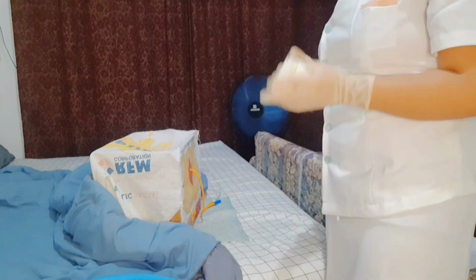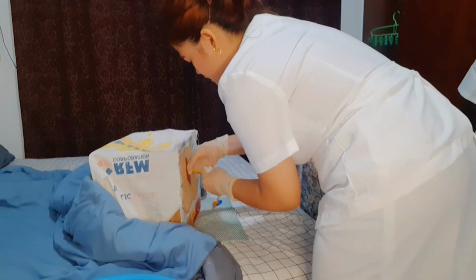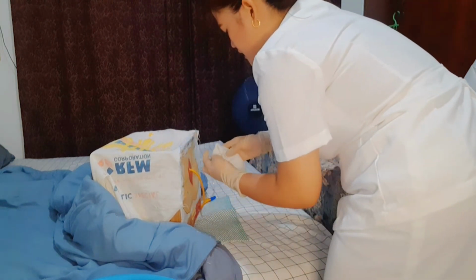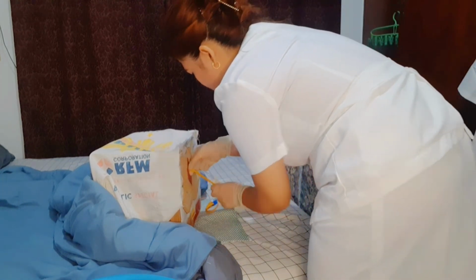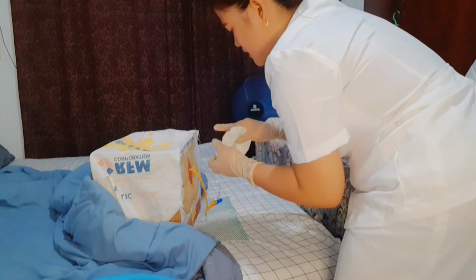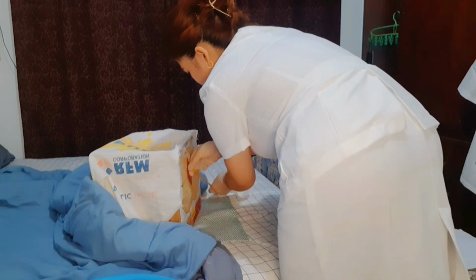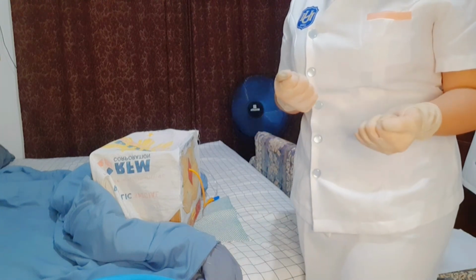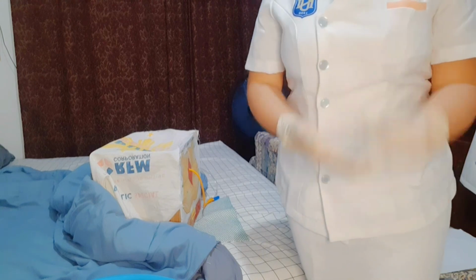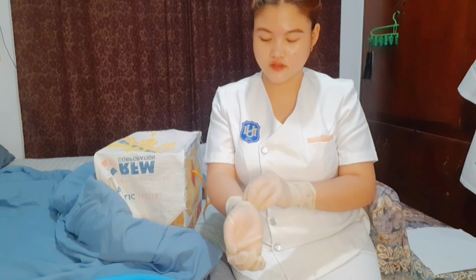And then after that, of course, the catheter as well. So hold the catheter and then clean it. And then the second stroke, hold the catheter and then clean it. And then the last part is this one, hold the catheter and clean it again. Then dispose of it. After that, you need to place the linen or cotton balls in a proper receptacle for laundry or disposal. After that, you need to remove the gloves.